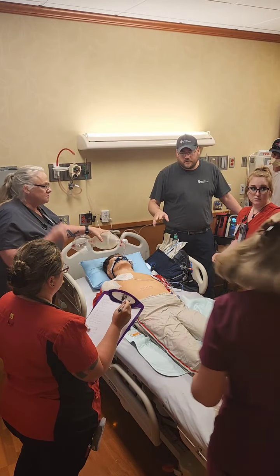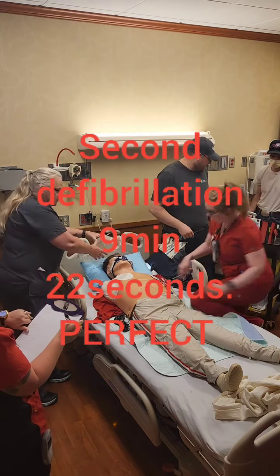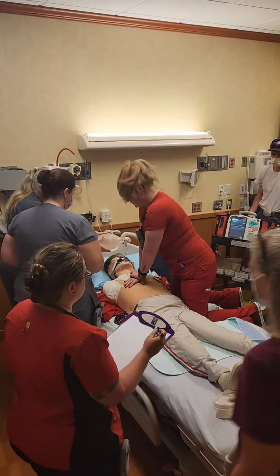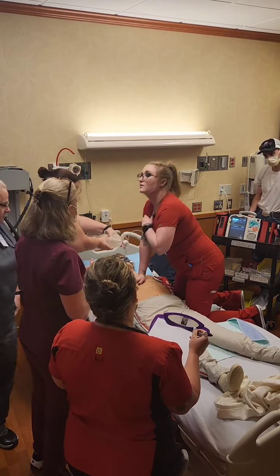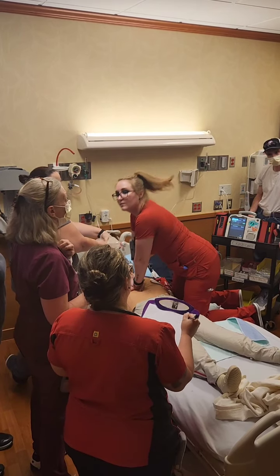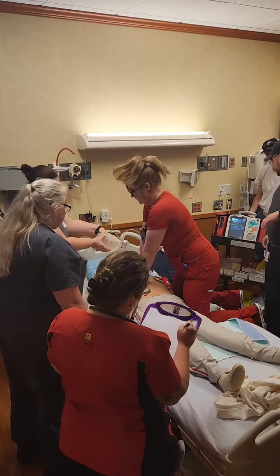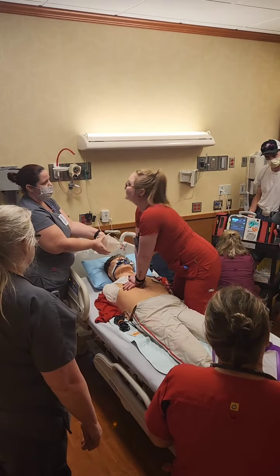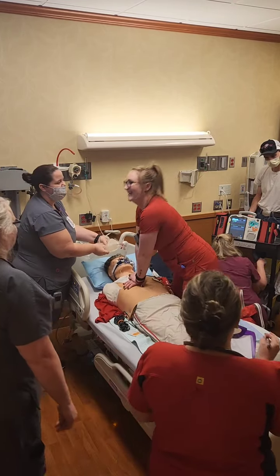Are you coming in, Liz? All right, everyone clear, gonna shock. Okay, clear now. Shock delivered, start compressions. You just did compressions, you guys are okay? I'll do the next time around. How much epi has he been given? That'll be our next drug, amio or lido. Let's do 300 of amio. 300 first dose. Okay, yep.